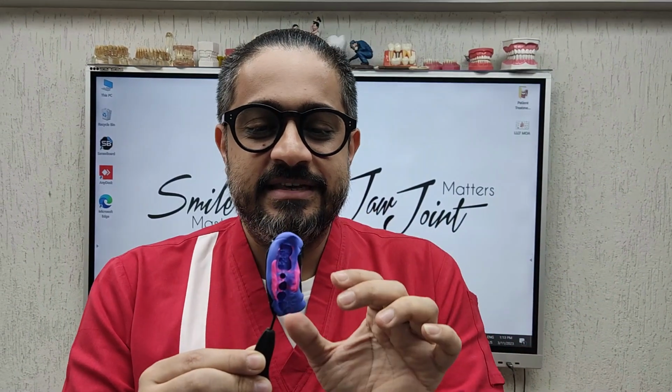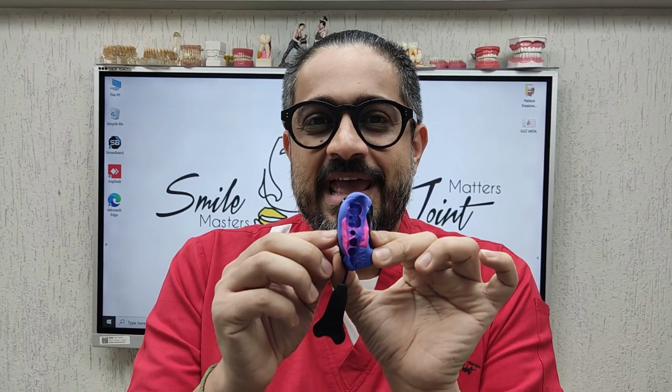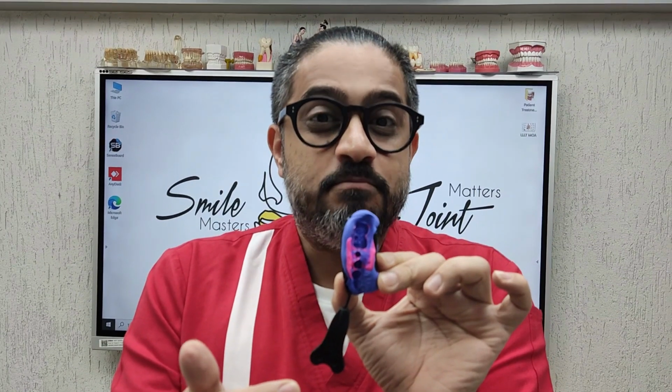And the reason I say this is not just because a metal triple tray saves time and material for me, but because it gives me a functional impression. The concept of a triple tray is a closed mouth impression, which means the tray is in the patient's mouth and the patient is biting on the material as it is polymerizing, which means the patient is in MIP, which is a functional position. I'm sure we all remember, as soon as tooth contacts tooth, there is an immediate intrusion, and that is the functional position that I wish to record for my implant scenarios.